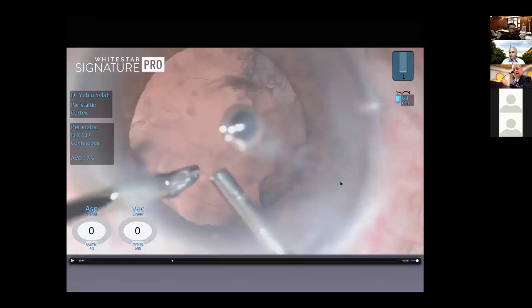I went out with the aspirating cannula, keeping the irrigation in to avoid the pressure gradient between the posterior segment and the anterior segment. If you go out directly with the irrigation, then the vitreous will move forward and this will increase the tear. So the first thing you identify, there is a tear. You see there is no vitreous. You go out with the aspiration, inject viscoelastic to equalize the pressure in front and behind the capsule, and then pull out the irrigation.